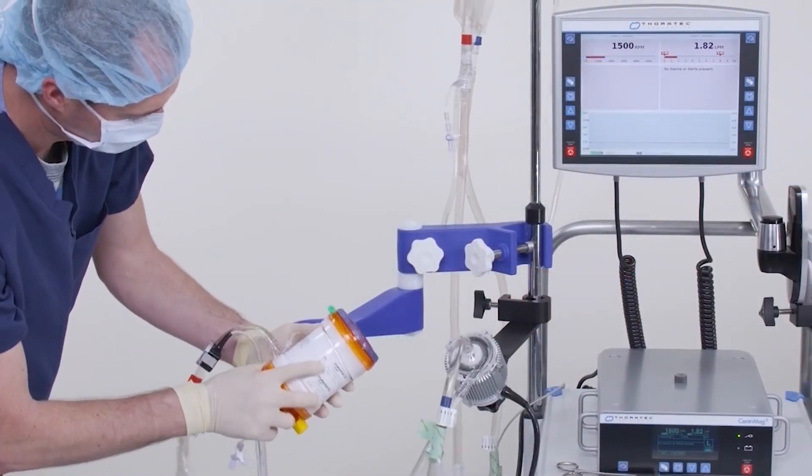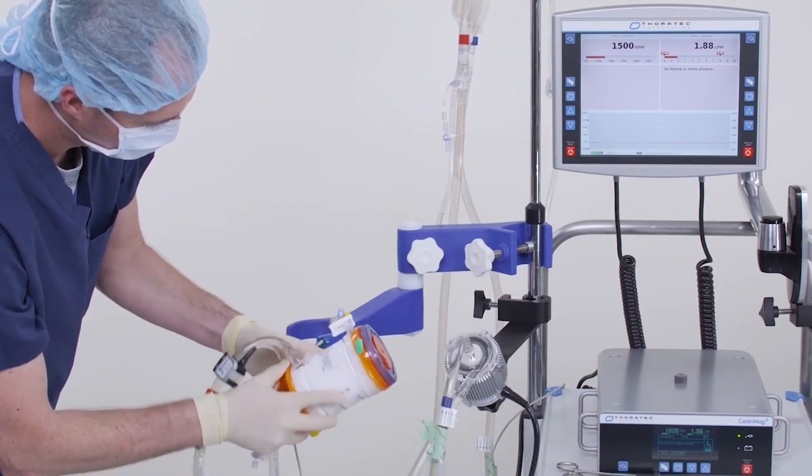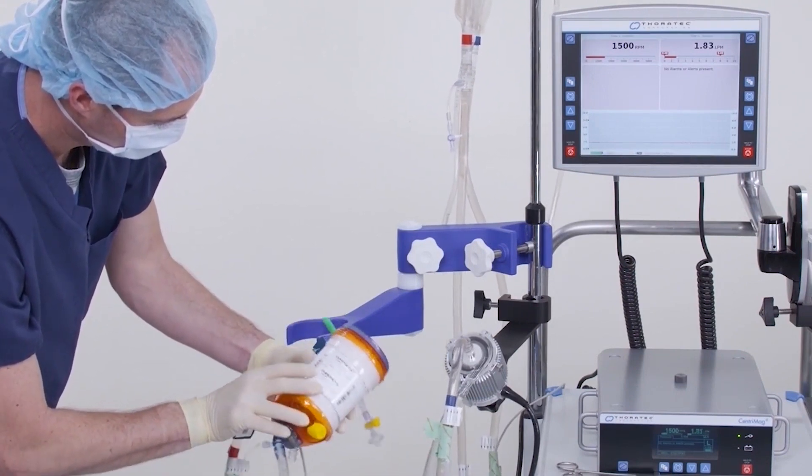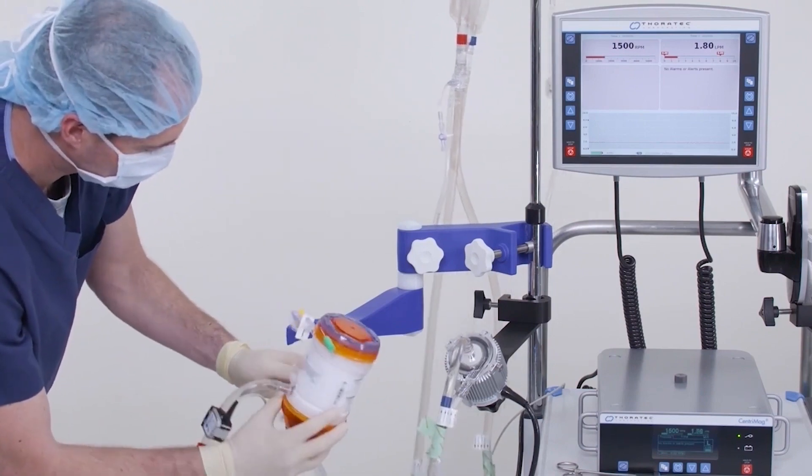Allow the fluid to recirculate through the circuit for 3-5 minutes to remove any micro-bubbles. The oxygenator may be repositioned to release any trapped air within the membrane.